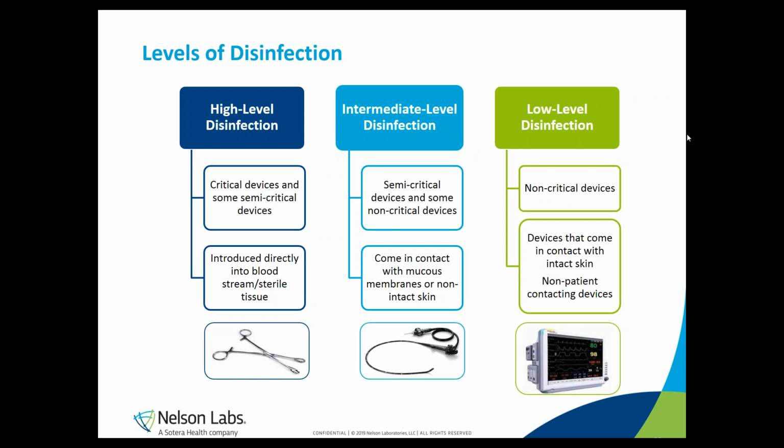Critical devices are devices that are introduced directly into the human body during a surgical procedure, so either into the bloodstream or sterile tissue. Devices belonging to this category may require high-level disinfection or even sterilization between patients. Scalpels, transfer forceps, and cardiac catheters are examples of critical devices.